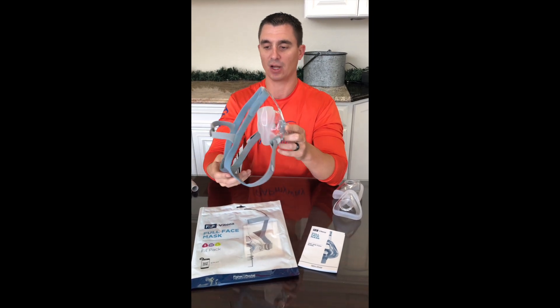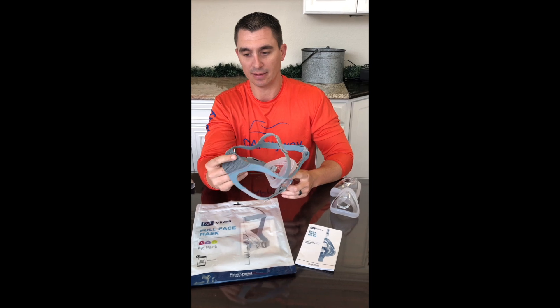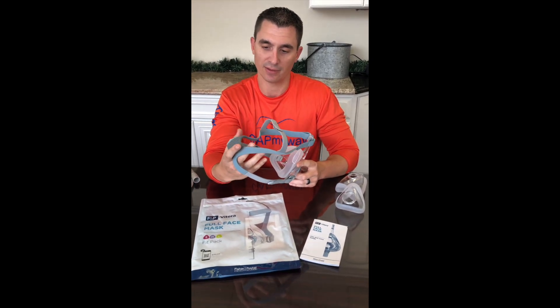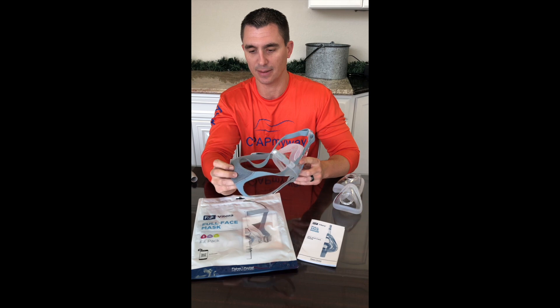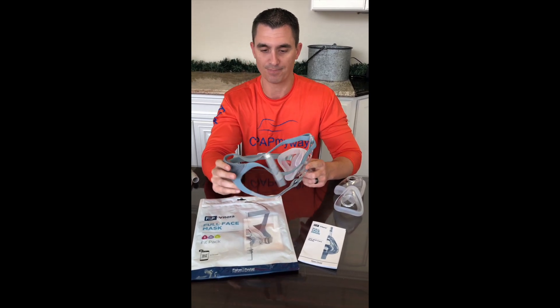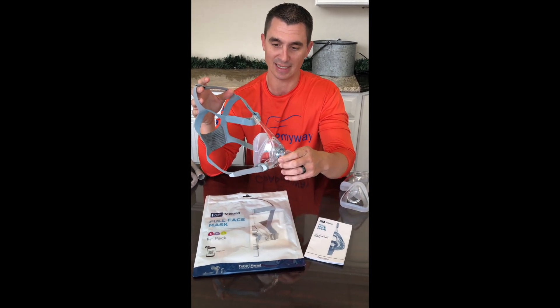Additionally, you've got a really modern headgear design. It's actually really well ventilated headgear because one of the things that Fisher & Paykel found is that full face users would actually genuinely get a little bit of sweat on their headgear, and over time that's really uncomfortable and certainly not the nicest thing to have on your CPAP mask every night.